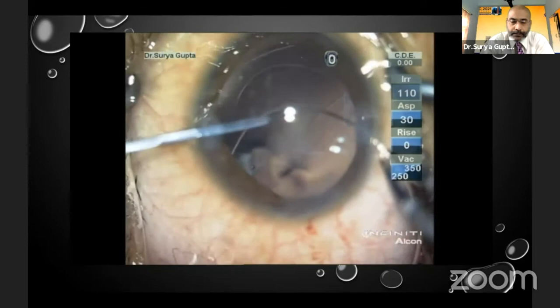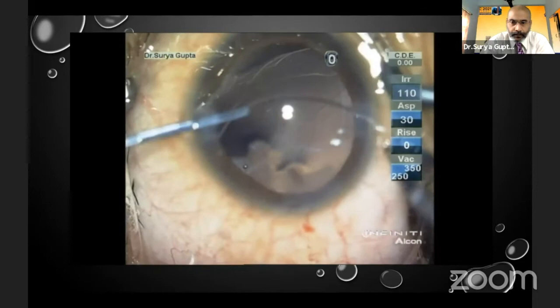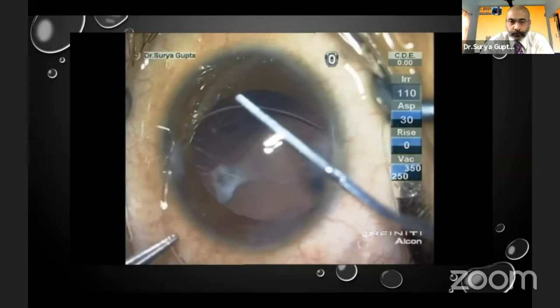Now this side port had a very acute, almost a 90 degree angle of attack. And you can see it's pulling the whole capsule to one side. And I decided this is not a great idea. So I decided to abandon this side port also. So now I go in from the other side port. Now this side port looked much more inviting. The CTR almost went in throughout the whole area. But again, whenever it was coming in this region, it was slipping out.